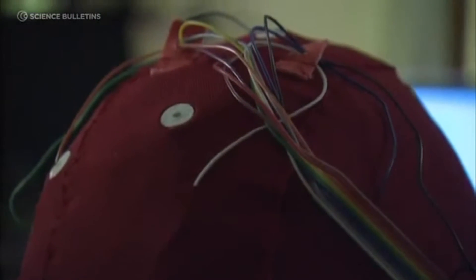The kind of system that Kathy's using is a very simple brain-computer interface system using EEG recorded from the scalp, and it works pretty well. But when you record from the scalp, you have activity from the muscles of the head, from the eyes, from head movements — other kinds of noise, essentially non-brain noise, that you have to recognize, contend with, and filter out.